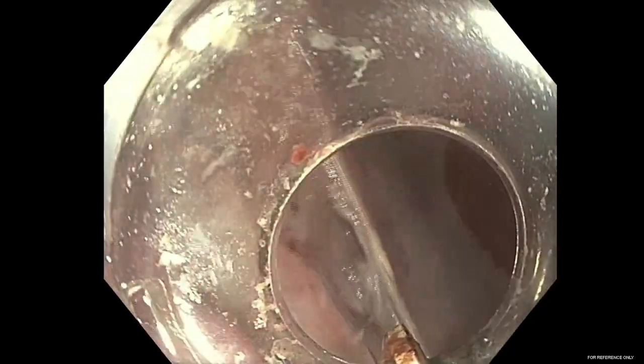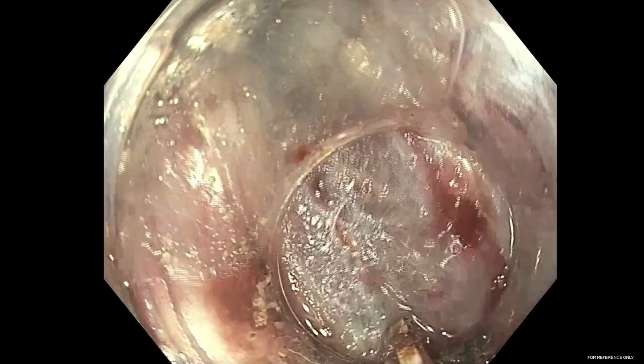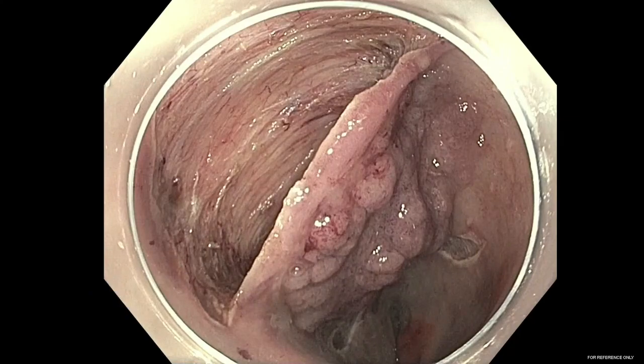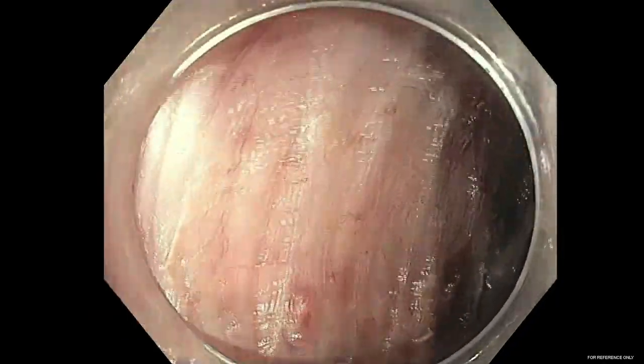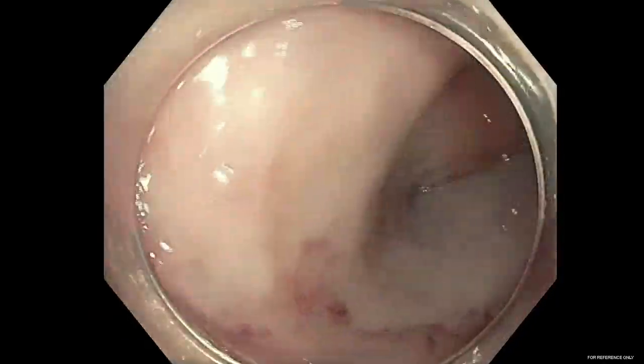Next, we determine and check the depth of tunnel, which is close to the oral incision line, prior to completing the endoscopic submucosal tunneling dissection technique. You can see the oral side incision as well as the endoscopic submucosal tunneling dissection that has thus far been performed. Closer inspection reveals the tunnel technique from the anal side of the lesion to the proximal or oral side.